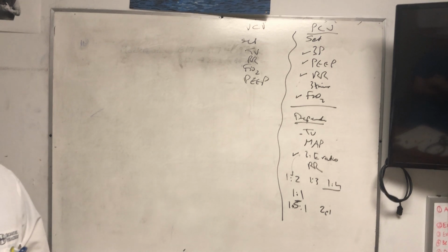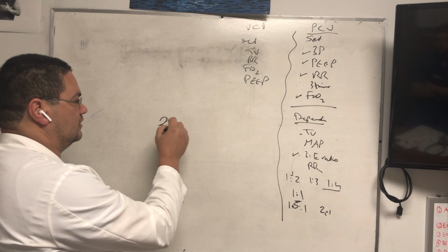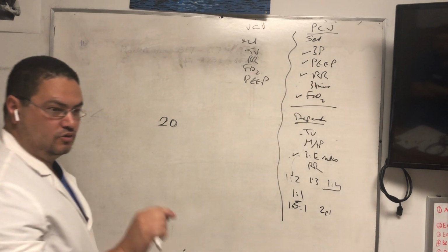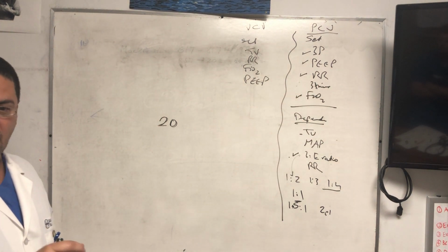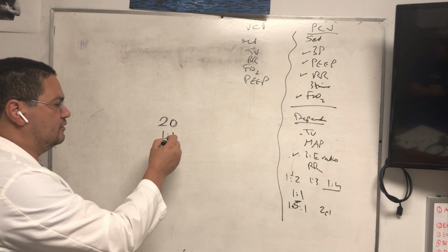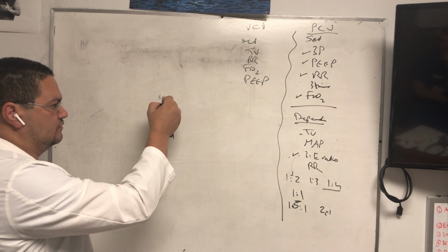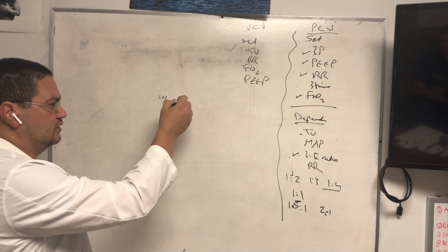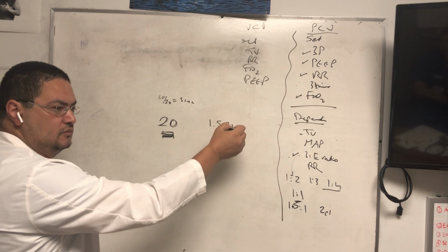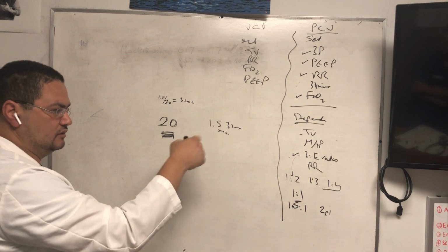Why? Because we're not there all the time, right? So if the patient is breathing at 20, the machine itself doesn't have a button that says I to E ratio. It has a button that says I time. So the respiratory therapist can only adjust the I time. Let's say I want a 1-to-1 I to E ratio at a rate of 20. I calculate 60 divided by 20, which gives 3 seconds per breath. So I want 1 to 1, so I'm going to give 1.5 seconds I time. Okay, great. So the respiratory therapist goes on and dials it as such.